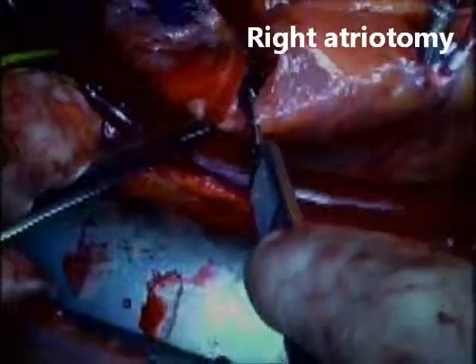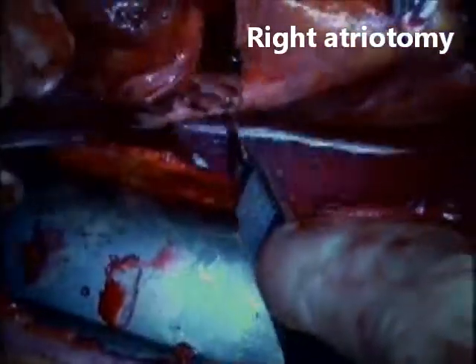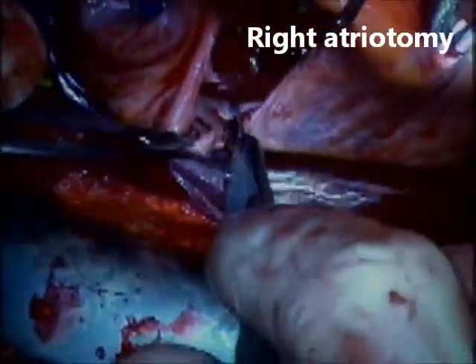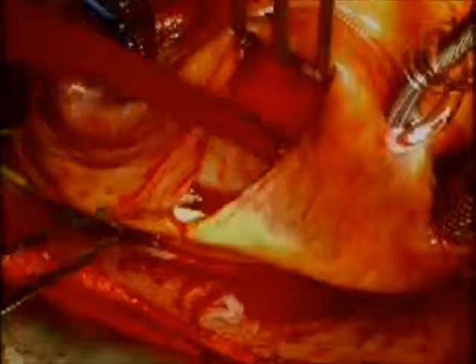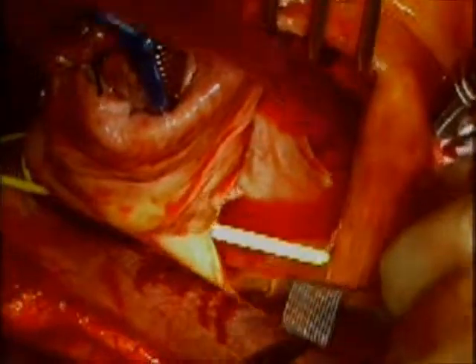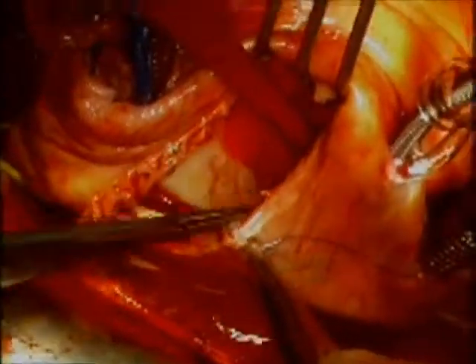I like to use a number 11 blade for this part of the operation and carefully proceed towards the posterior aspect of the right atrium to identify the Swan-Ganz catheter — you can see the yellow line there. I normally leave it in place because it doesn't obstruct my view and makes it easy for the anesthesiologist to have the Swan-Ganz already in place at the end of the operation, especially if you are planning to do a tricuspid valve repair.